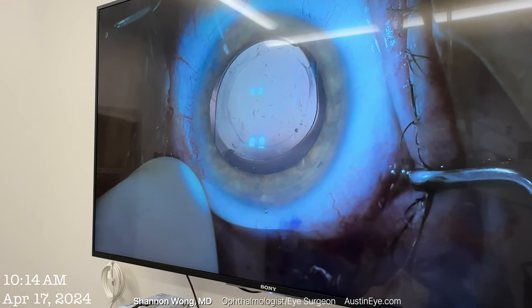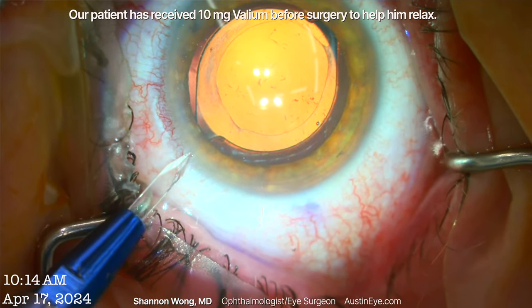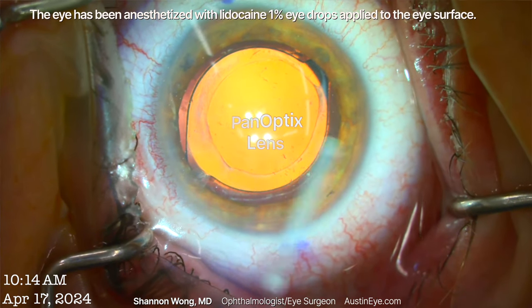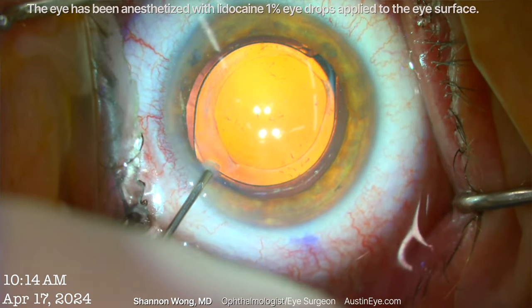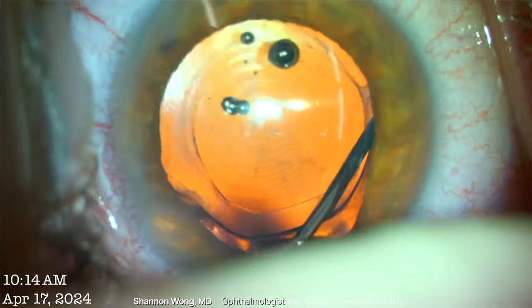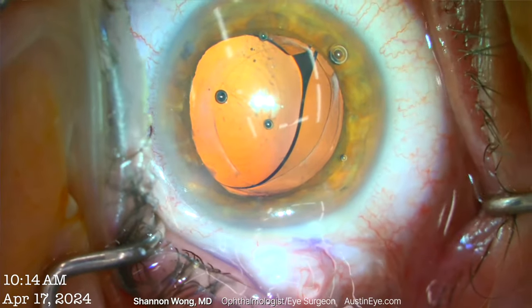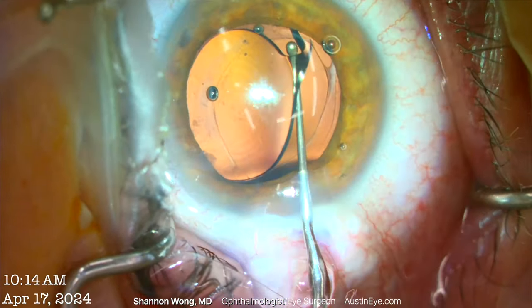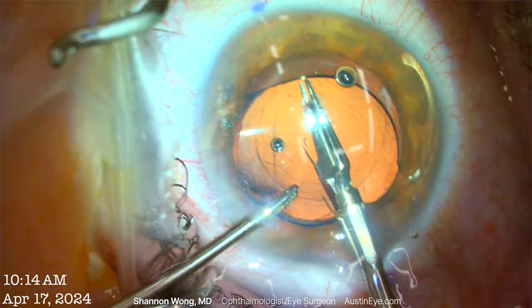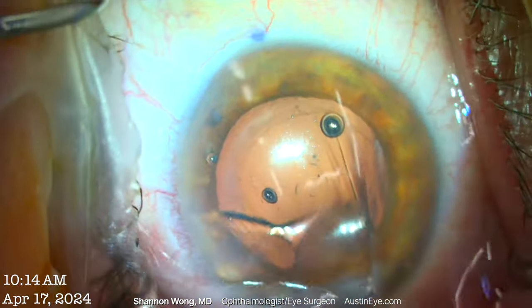We're moistening the surface of the eye. We fill the eye with viscoelastic and then elevate the lens implant from within the capsular bag using viscoelastic. A Connor wand is used to dial the implant into the anterior chamber. IOL forceps and cutters are then used to bisect the lens, and it is removed in two pieces.